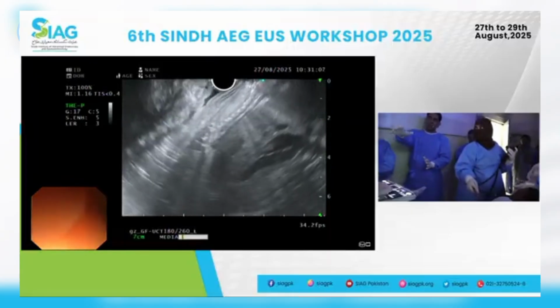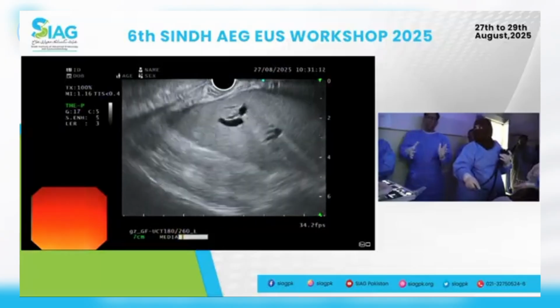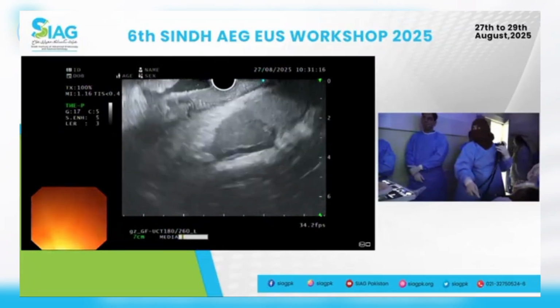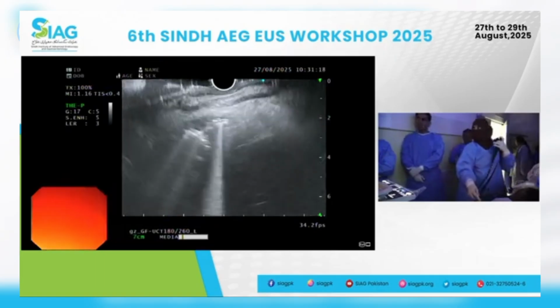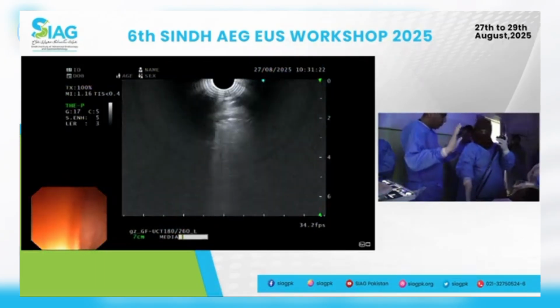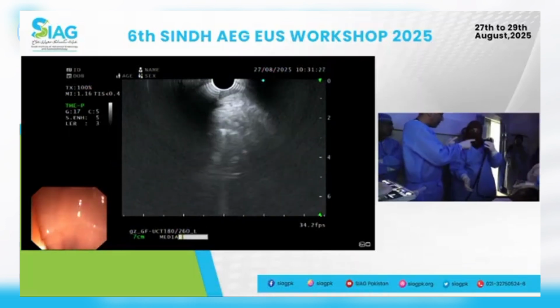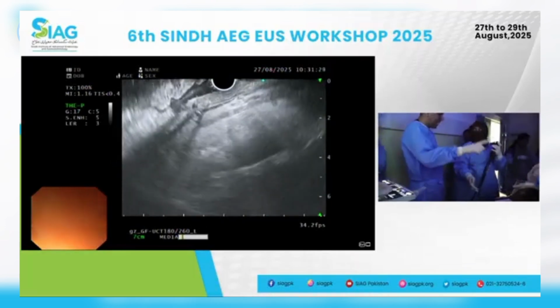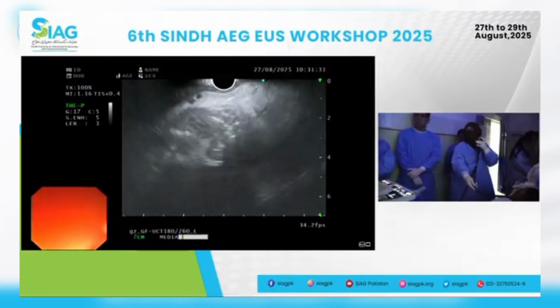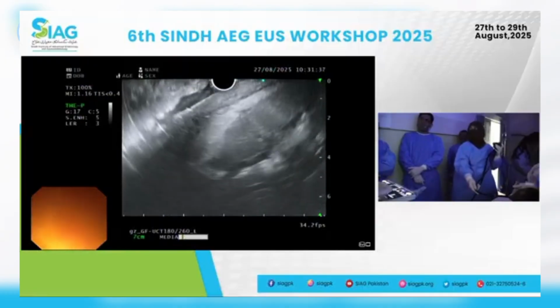You can, but obviously at the same time you can scan the plane and just slowly rotate. So if you're going to go from the patient's right to the posterior, okay, good. So clockwise rotation, good. The other thing, I'll stop you there. Exactly. So just remember, you need to step back a bit. Make sure every movement that you're making here, you're able to transmit exactly. Fantastic. So keep it as straight as possible with the right hand. Good. Very nice. So go back to your image where you had earlier. Good. Very nice.